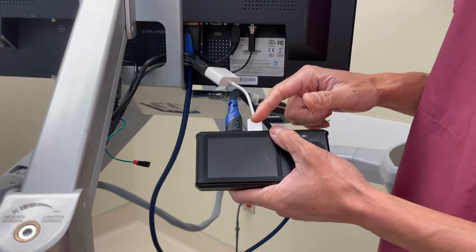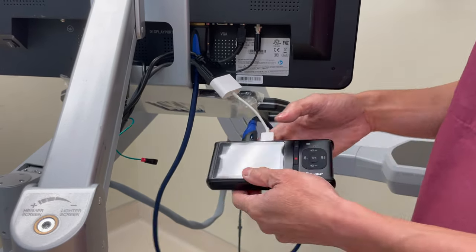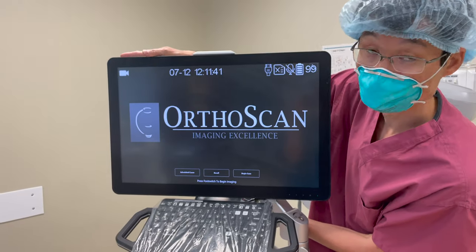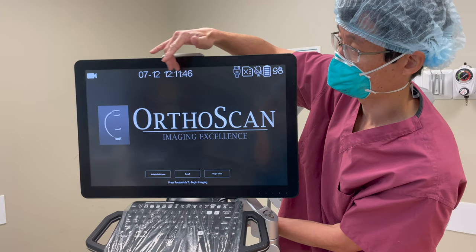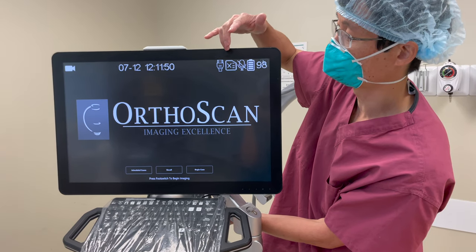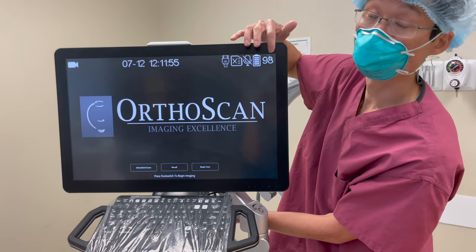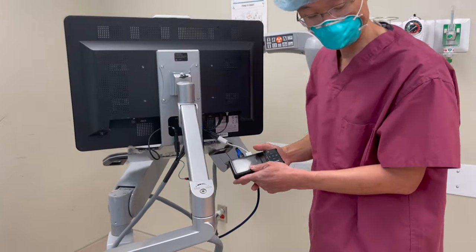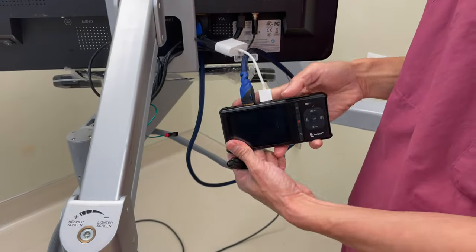If everything works correctly, you should have a signal that's still set for the scan, but now it's different — it has a little camera icon up here, a date and time, and several things coming from the ClearClick. You'll see a notification that there's no memory stick attached and an indicator showing how much battery is left.